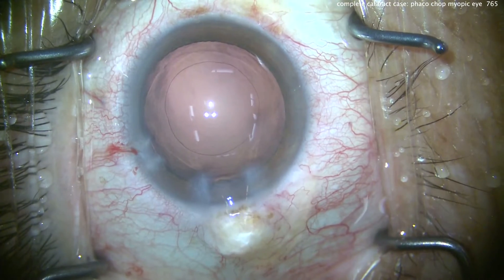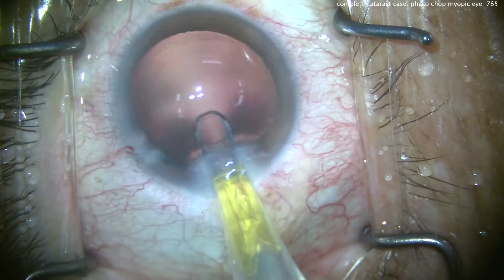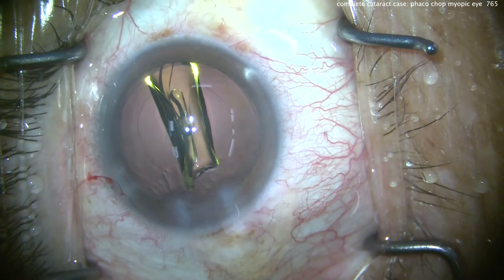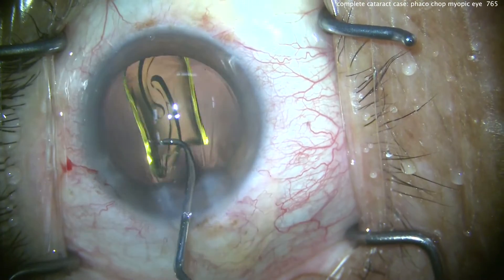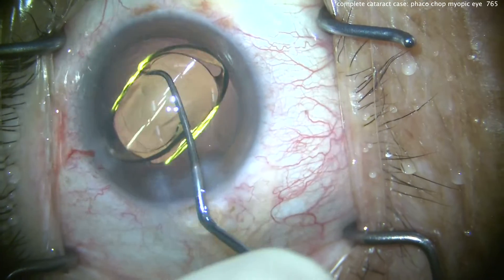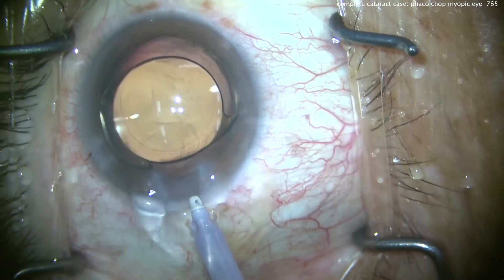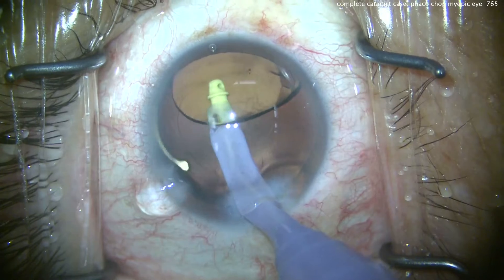There's the capsular bag beautifully filled up with viscoelastic, and now we're going to deliver our IOL. Here comes a single-piece acrylic lens going right into the capsular bag. We'll get this centered up and make sure the haptics unfold. You can see this IOL looks pretty small in this big eye, but of course it's a normal size lens. We've got the lens rotated and lined up, and you can see the overlap of the optic by the capsularexis, which looks great.